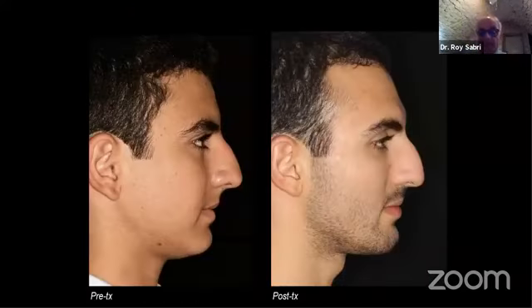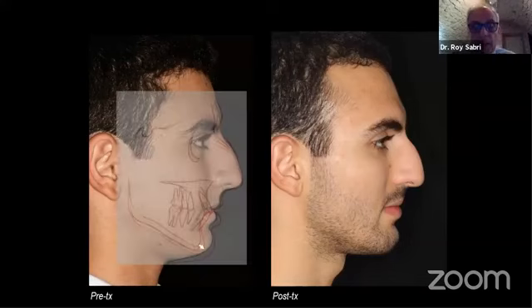And here's the end result. Okay, managed to grow some nose and some chin. But if you notice, by proclining the incisors, we gave him some lip support, and we're able to compensate for nose growth and chin growth, as you can see.